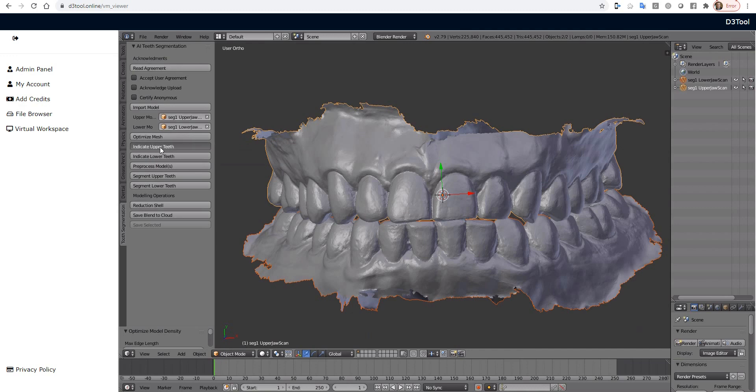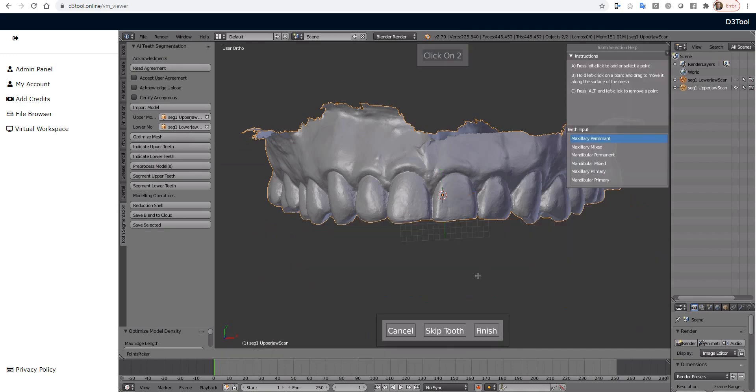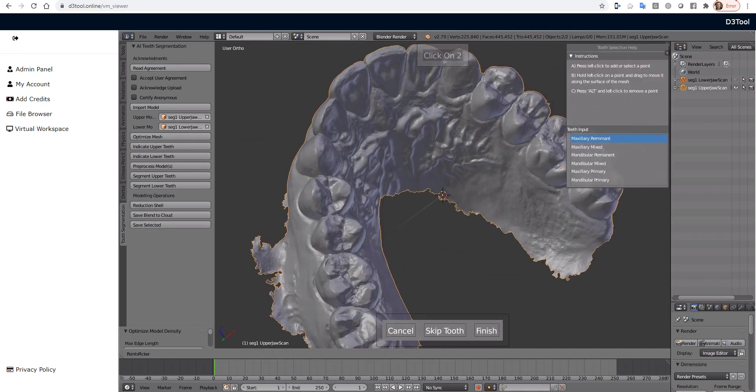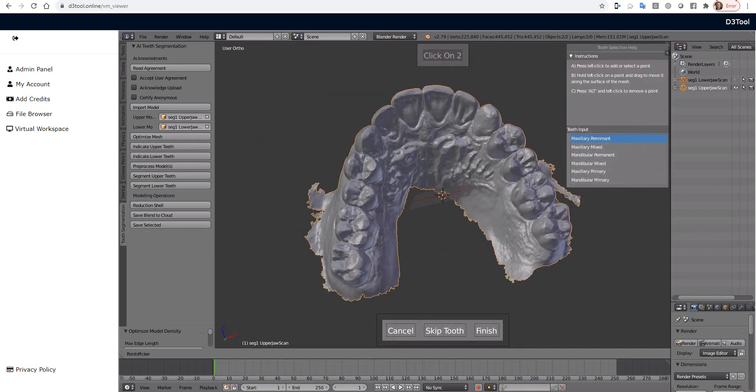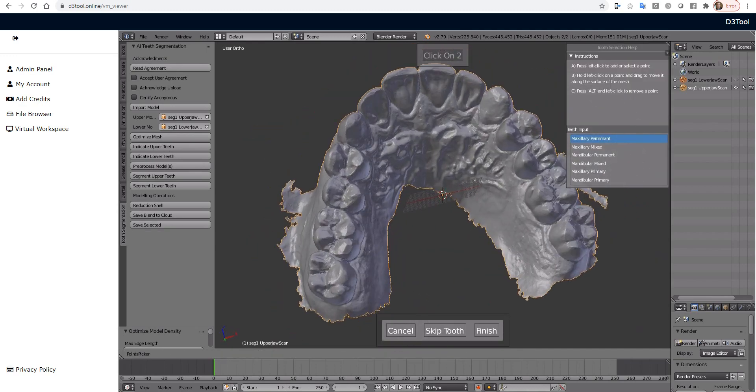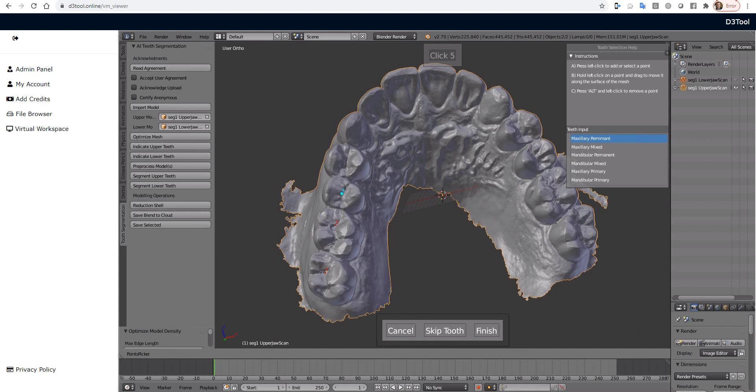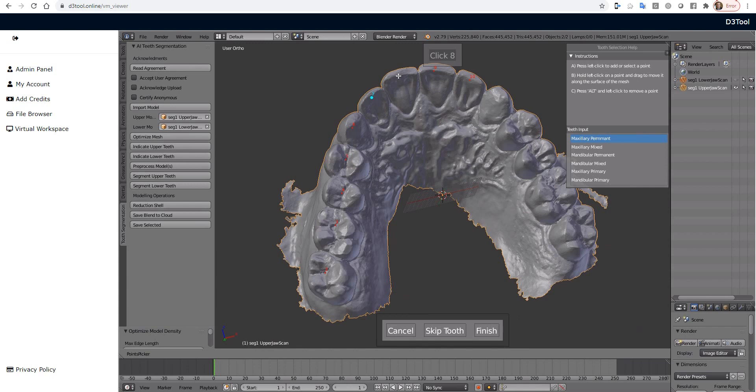Now we're going to indicate our upper teeth. So I'm using the U.S. numbering system. So it's going to ask me up here which teeth we want to segment. If you need to skip over a tooth, like for example if 8 were missing, we could press Skip Tooth. And then we'd click right on 9 or 10. And whatever the last tooth you click on, it's going to ask you for the next one. 8, so 9, 10, 11, 12.